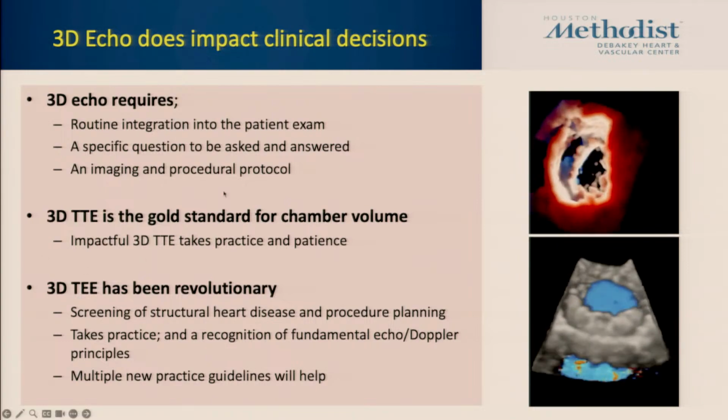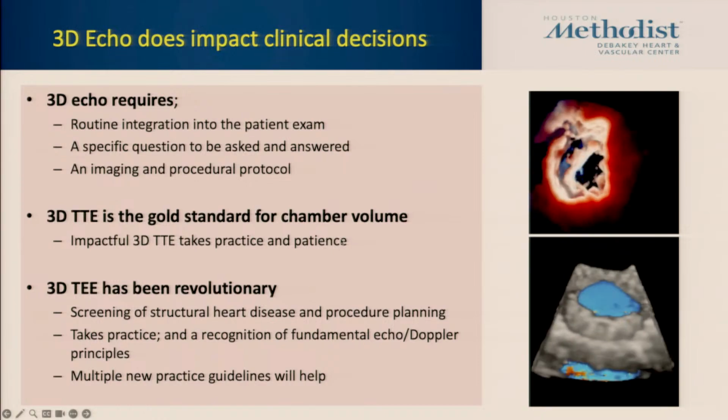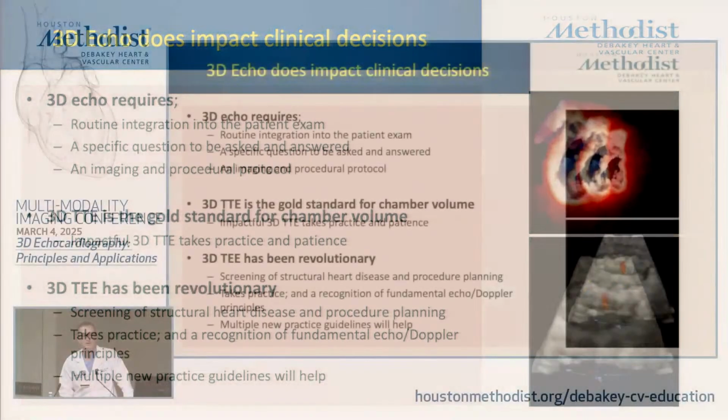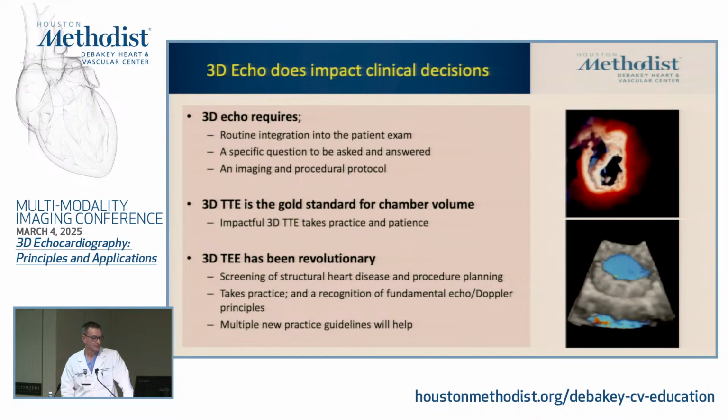You should be asking a specific question and answering it with 3D, and it's got to be integrated. It takes practice and patience. If you never do it, you'll never get better at it. But the software, the probes, the tools are much better now than they were even 5 years ago. So I'd encourage everybody to try it.